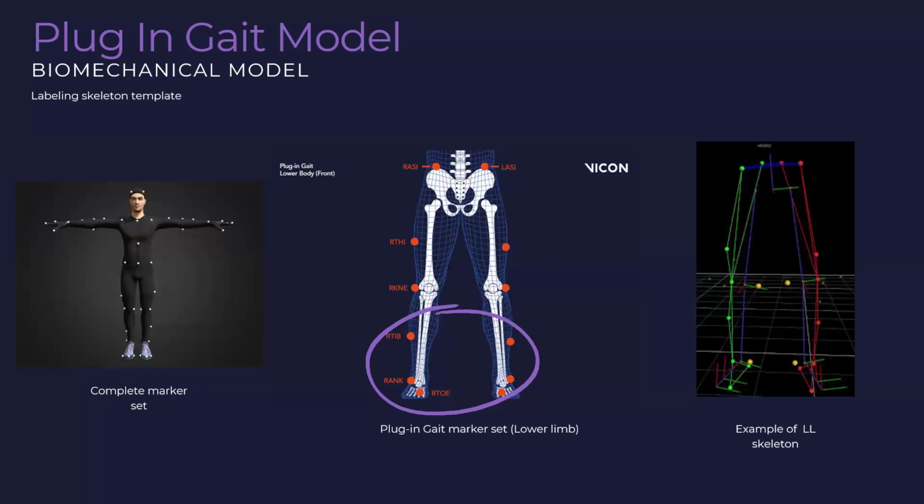But the objective is to put the center of pressure trajectory in a cost function at the end, to have a standardized trajectory from healthy patients and try to stick to this trajectory, even if you have disabilities. So the objective is to go back to a normal trajectory.